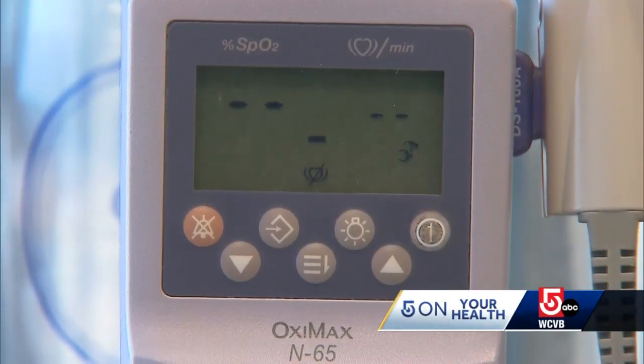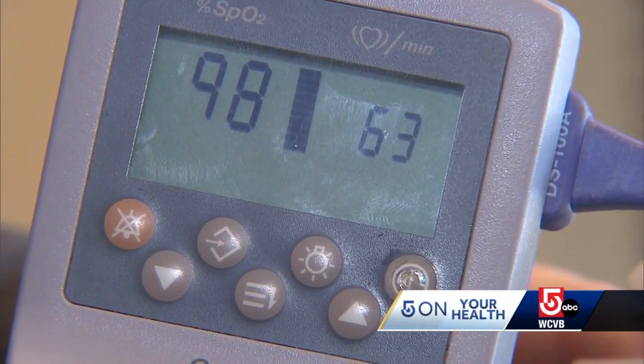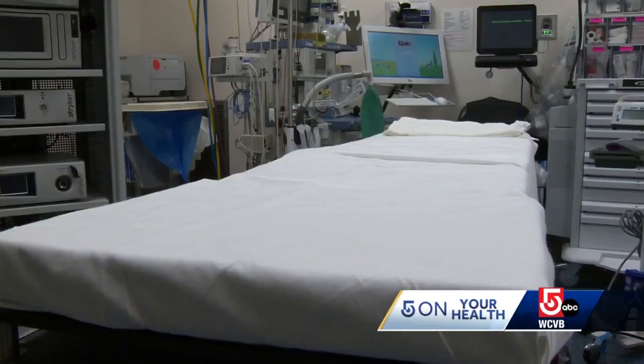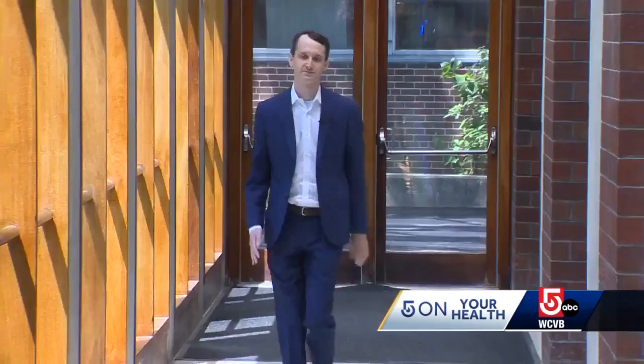And now a Boston study shows among 3,000 people hospitalized in intensive care, patients who are Black, Hispanic, or Asian were more likely to have false readings. As a result, those patients received less supplemental oxygen than white patients. This is something that's a little bit shocking just when you think about that we're really not treating patients equally. And patients will do better across all races and ethnicities if we can improve the way we measure and then treat them.